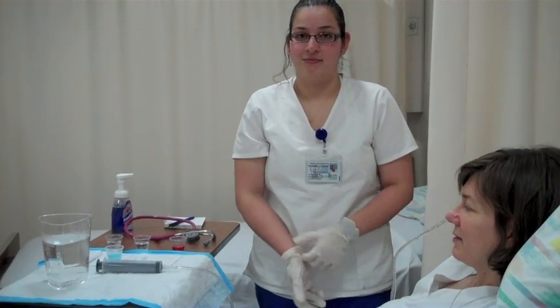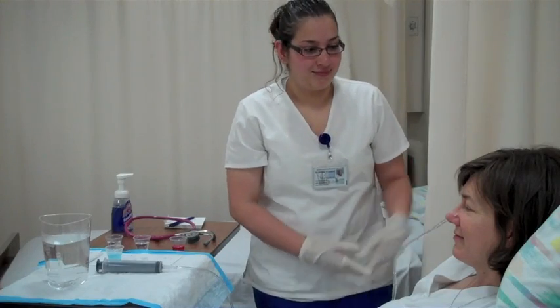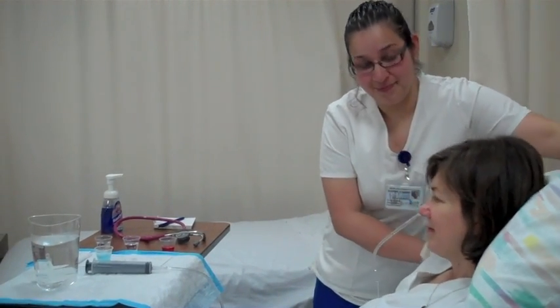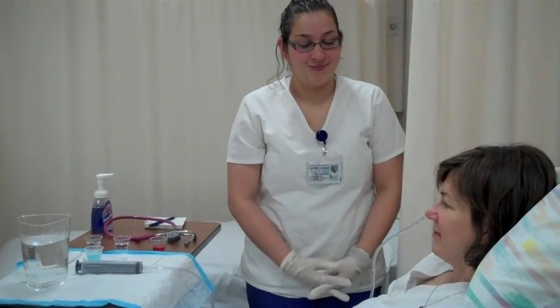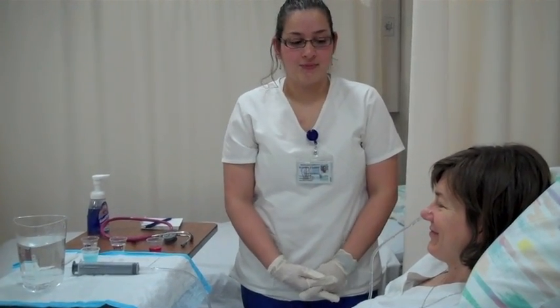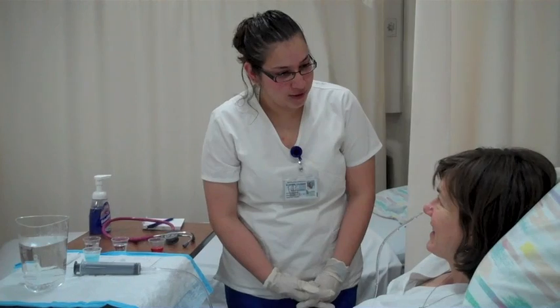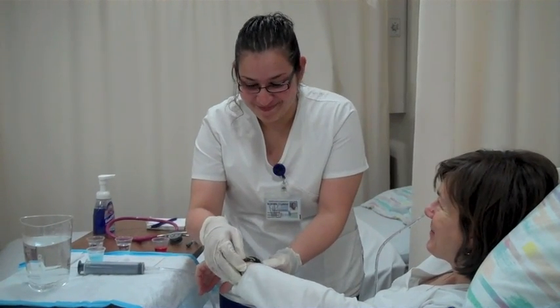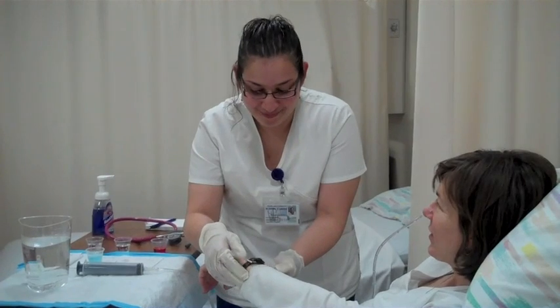Step 4. Assist patient to high Fowler's position. Ask them to state their name and date of birth. Can you tell me your name and date of birth? Yes, my name is Fergie Johnson, and I was born on April 24th, 1970.